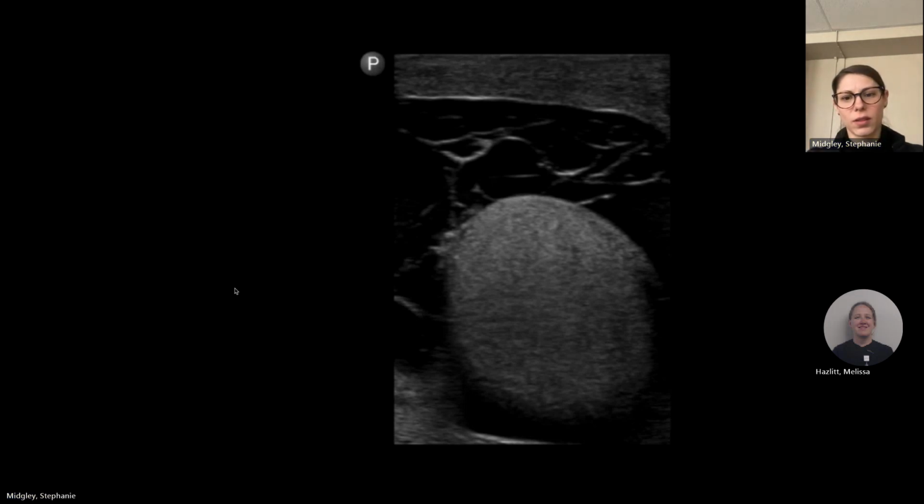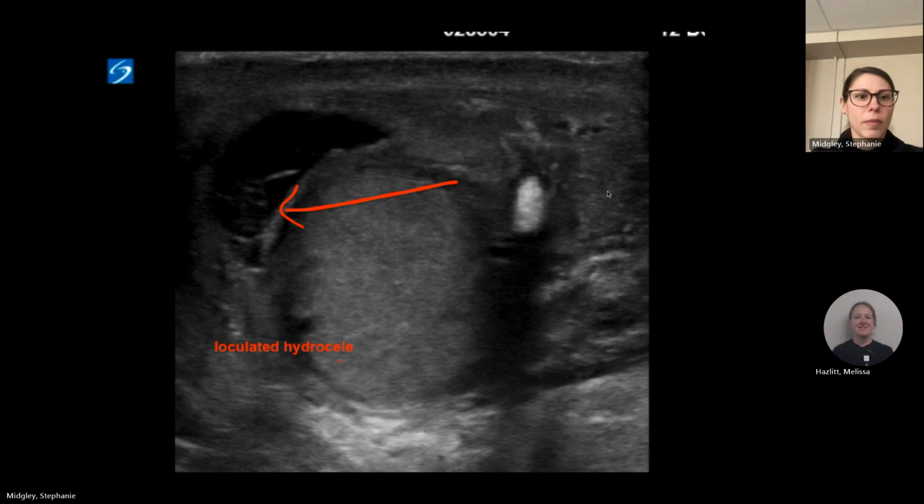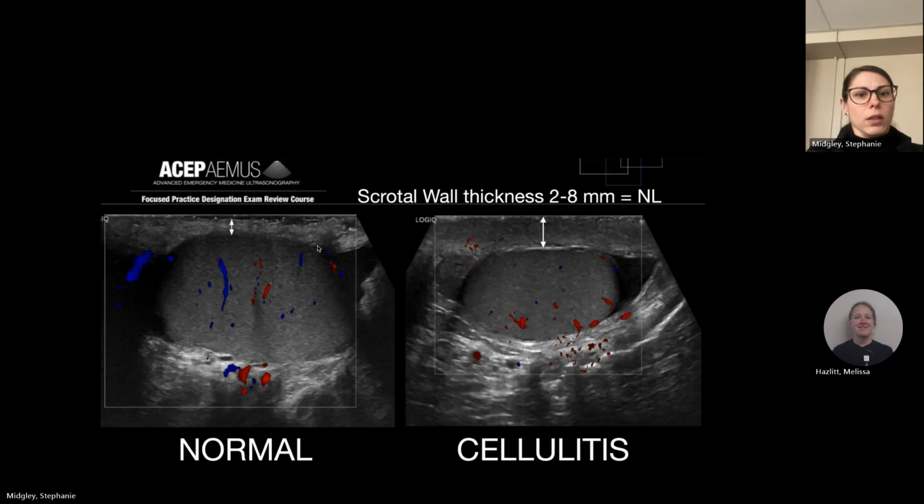So what do we think is going on here? So it's a pyocele. So basically it's just a loculated collection. Complications from untreated epididymo-orchitis or a rupture of an intratesticular abscess. Usually you're going to see lots of septations within that hydrocele. And then here's another example. We're starting to get some loculations within. That's probably epididymis there, but you can see there's a little bit of a loculation there. All right. Again, stolen from ACEP's ultrasound review course.